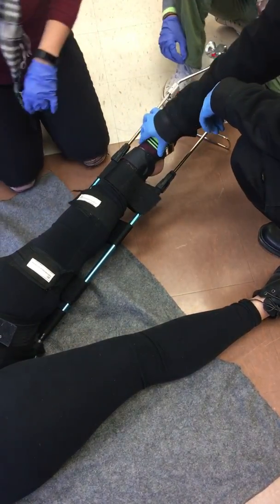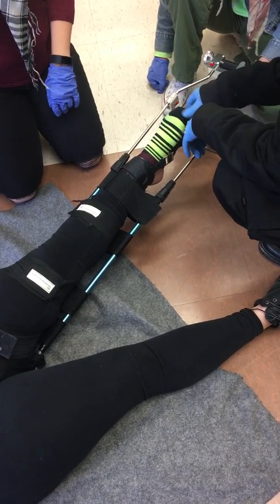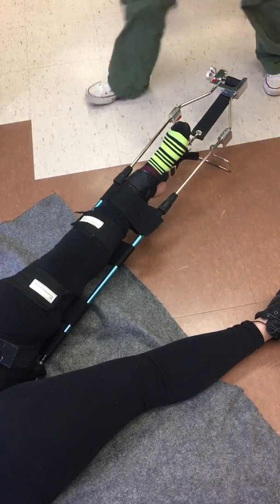All right. The pulse. You wiggle your toes. Which toe? Very good. Uh-oh, it looks like her other leg has something wrong with it. You have pain in your other leg too? Yep. Oh, her other leg's broken. So we gotta do some long board splint now.